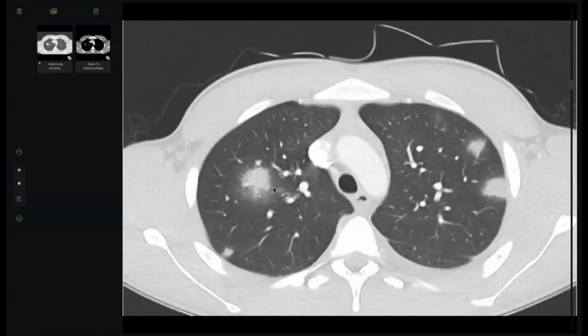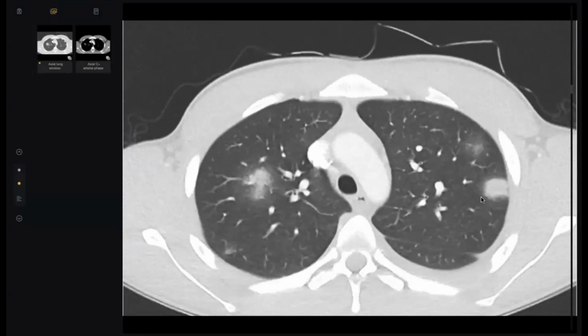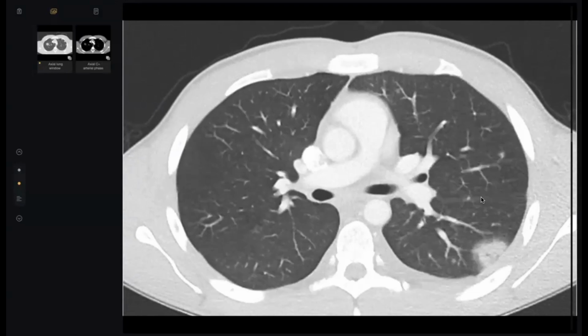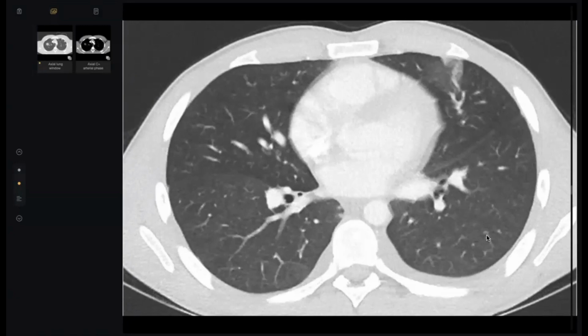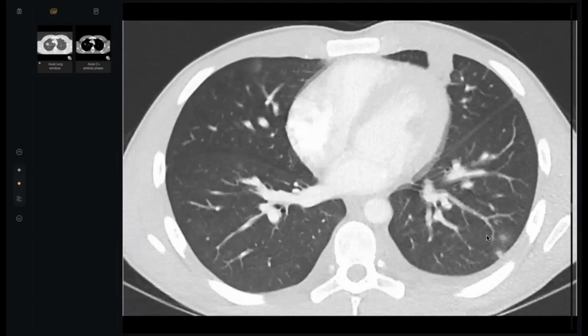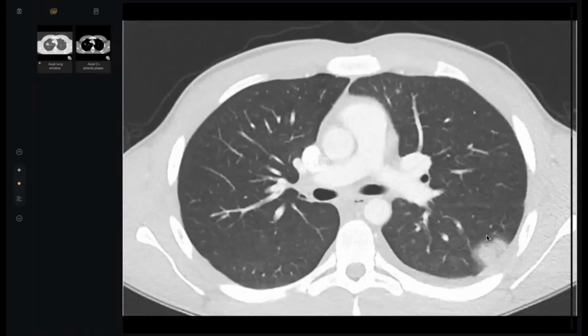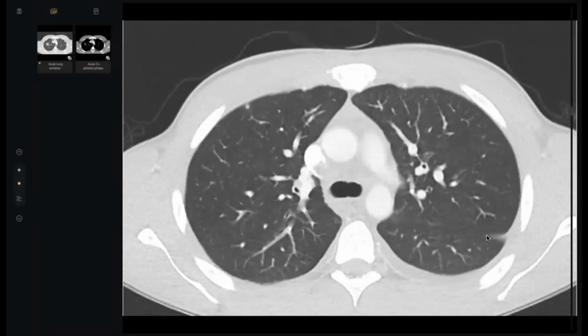But see, doctor, one second. The distribution here is peripheral. Is this possible in rheumatoid? What is the significance of a peripheral distribution? It could be vascular in origin. No, not vascular in origin. You are very near. It is blood-borne. Yes, vascular, blood-borne. So I was thinking about septic emboli, because septic emboli is blood-borne and can cause cavitation.